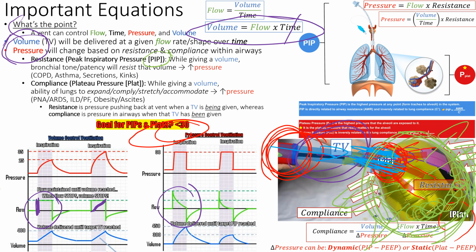We say, hey, the PIP's high. Was it because of the upper airways? So I'm going to test it. I'm going to look at it. I can look at my end-tidal CO2 and see sharp waveforms. Oh, I'm going to give some breathing treatments, and look at those PIPs. It came right back down, right?